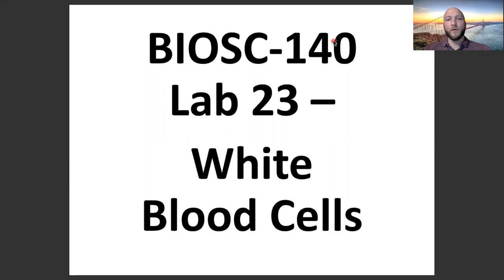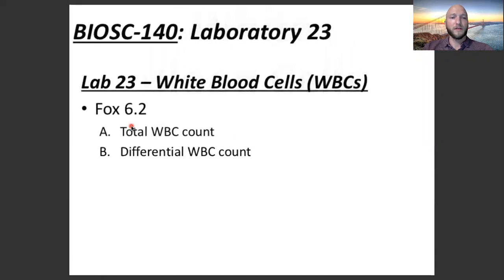This video will be the experimental procedures video for Lab 23, which covers white blood cells. Pop quiz. What is another name for a white blood cell? If you've been following along in lecture, you should be ready for this question. Another name for a white blood cell? Leukocytes, or WBCs, is another way you'll see it.